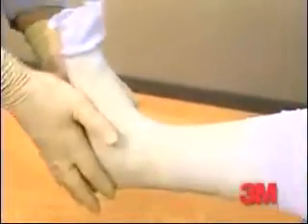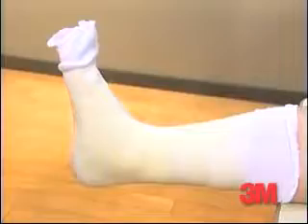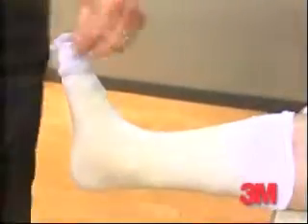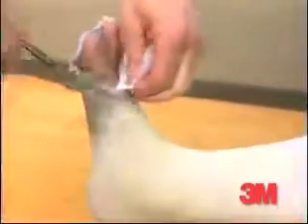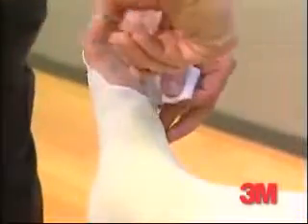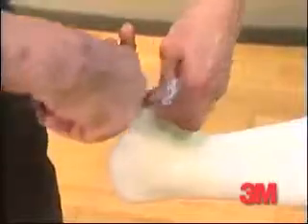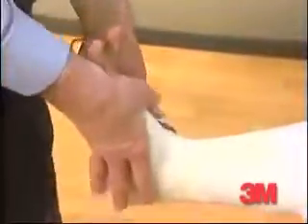So we've reached our setting time, and the trimming of this material, because it's resilient and the edges will not cause any abrasion or digging in to the patient, we can just trim with our scissors. And we don't need to roll the stockinette back and capture it in the material. That just creates bulk under the shoe. So this allows for minimizing bulk under the athletic shoe. And we can do the same proximally.